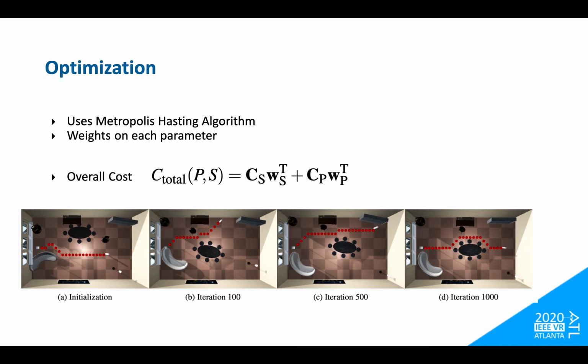During the optimization, starting from the wheelchair, the A-star algorithm, a widely used pathfinding and graph traversing algorithm, is employed to generate a random path in each iteration. Randomly sampled paths are accepted when they are closer to the target path than the previous path, until the best path is found, given the currently synthesized layout of the scene.